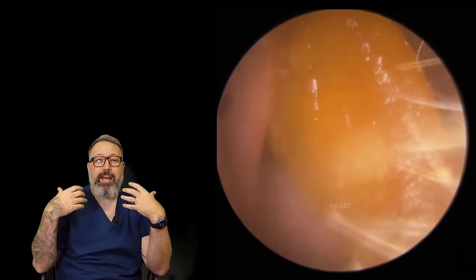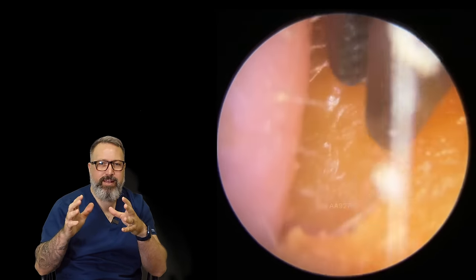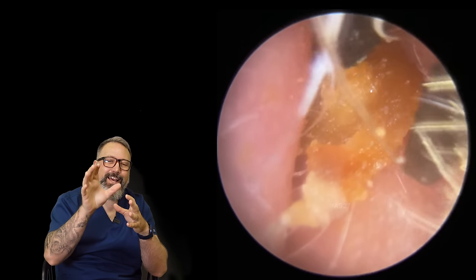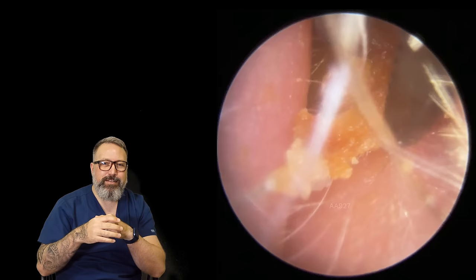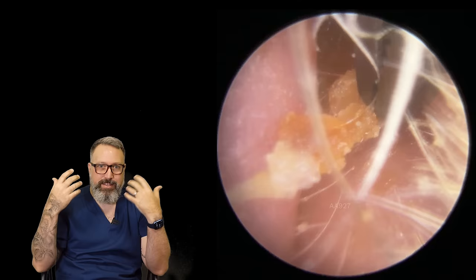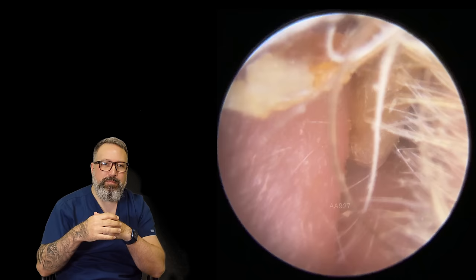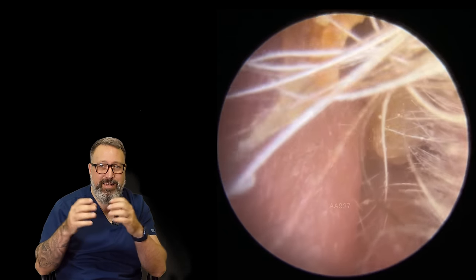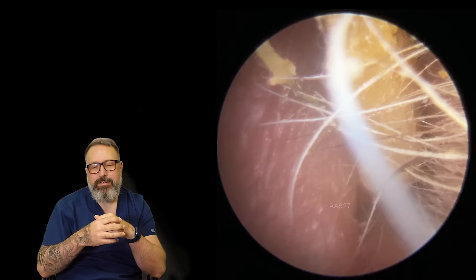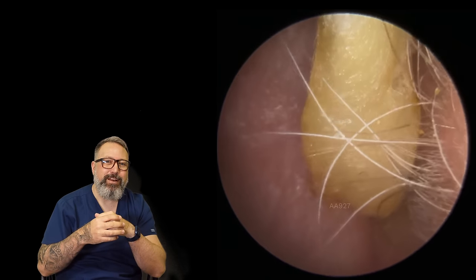Now this is actually one of my patients. This was an emergency appointment that came through. Lovely gent, comes to see us quite regularly. But he's got the end of a cotton bud stuck in his ear canal here - the whole end of the cotton bud, the Q-tip, has come off in his ear canal. So he just walked into the clinic and said, look, this is the case, can you help me out? So we got him in for an emergency appointment. And you can see it's literally the whole head of the cotton bud that's come away - quite a big old plug.